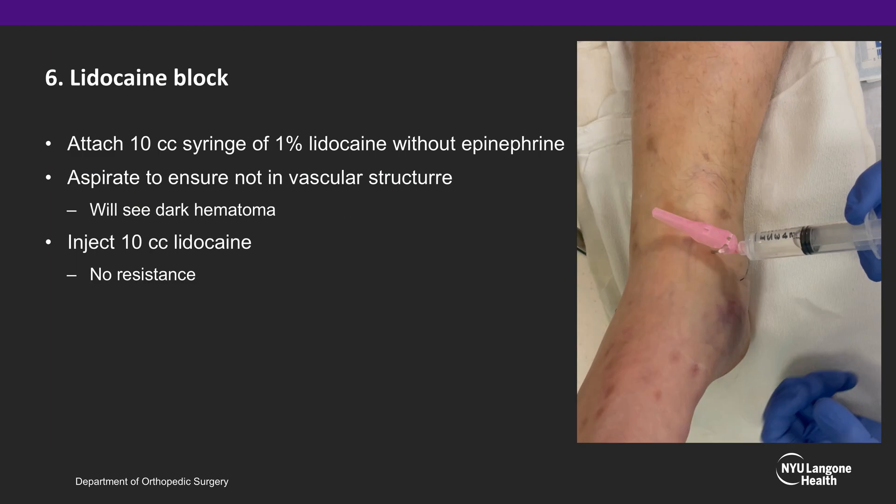Attach a 10cc syringe of 1% lidocaine without epinephrine. Aspirate to ensure you are not in a vascular structure. It is okay to see dark hematoma, which is normal, and then inject the 10cc of lidocaine into the ankle joint. There should be little to no resistance when injecting the lidocaine.